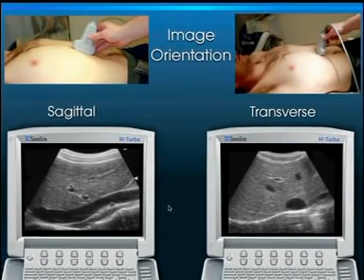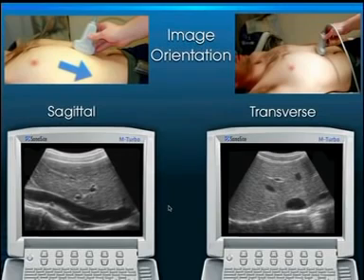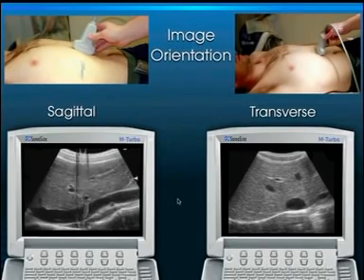But if I accidentally aim the indicator down towards the feet because I wasn't paying attention, now this IVC is upside down. And when that IVC is upside down, while you can still interpret it, it's an upside down image and goes against the convention in the United States. And over time, that appearance should feel like fingernails on a chalkboard to you. So I'm going to turn it back right now because that's having that effect on me.